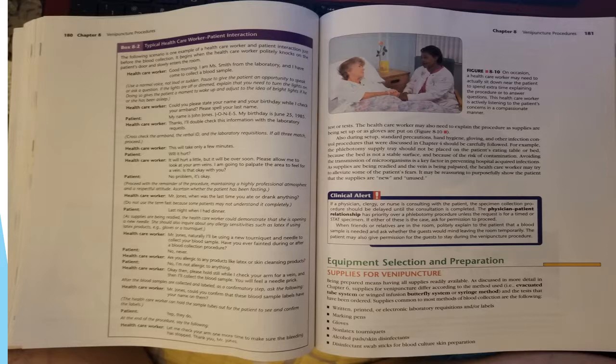When friends and relatives are in the room, politely explain to the patient that a blood sample is needed and ask whether the guest would mind leaving the room temporarily. The patient may also give permission for the guest to stay during the venipuncture procedure. Now on page 180 is box 8.2.